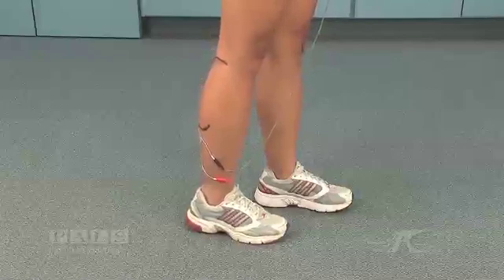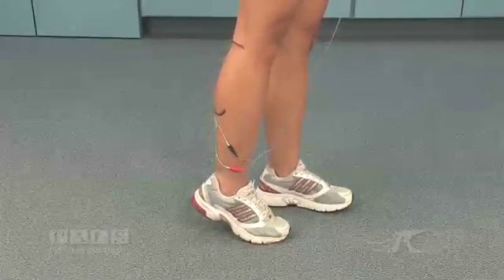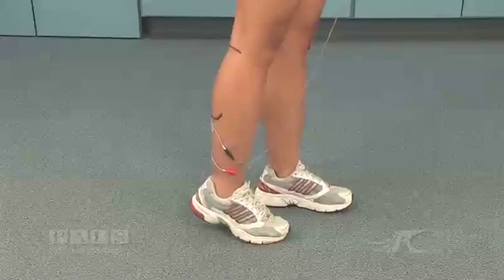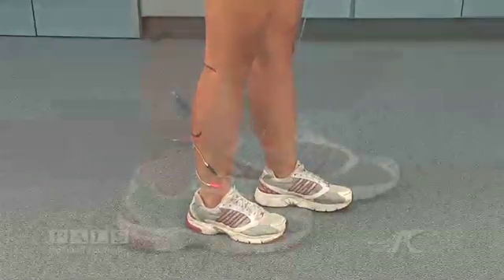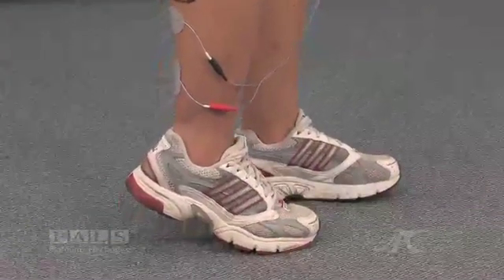During stimulation, the stimulated extremity is slightly unweighted with the opposite foot placed in front. Heel rise can be seen during stimulation in this position.